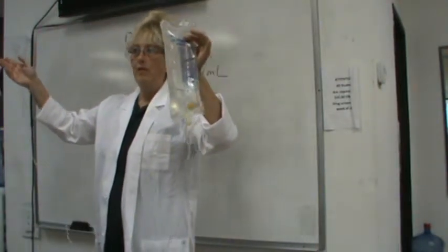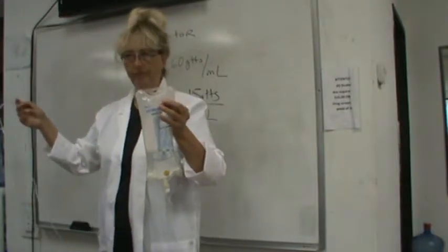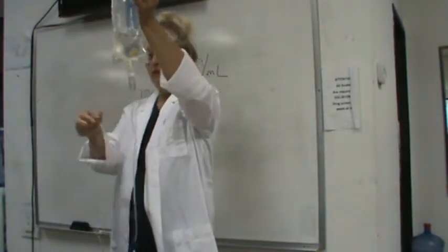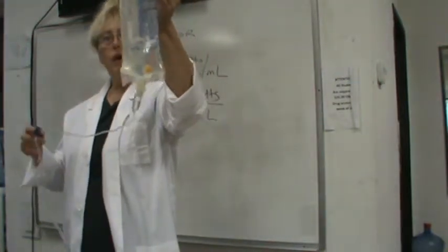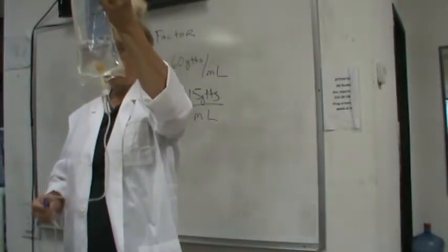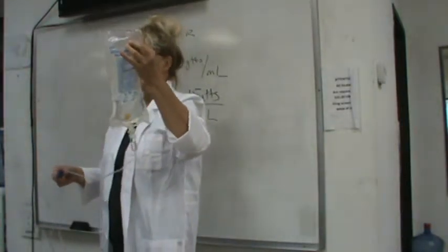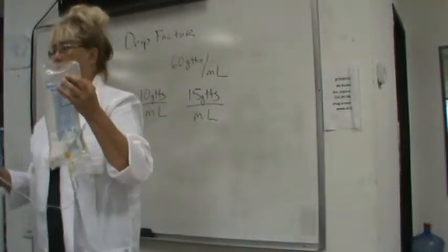That's awesome. Now you just learned something that they don't even teach you in nursing school. And you didn't lose your fluid, and take a look at your drip chamber. If this is locked all the way, your drip chamber shouldn't really be dripping. Gravity might drip it though, okay? So, did we do it? Yes. Wasn't so bad, right? No, that was easy.